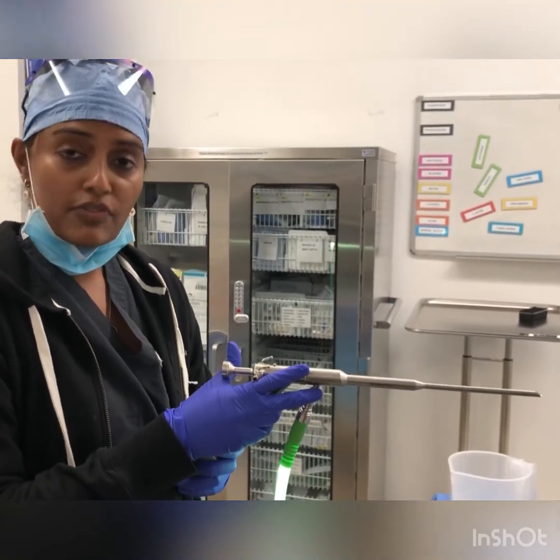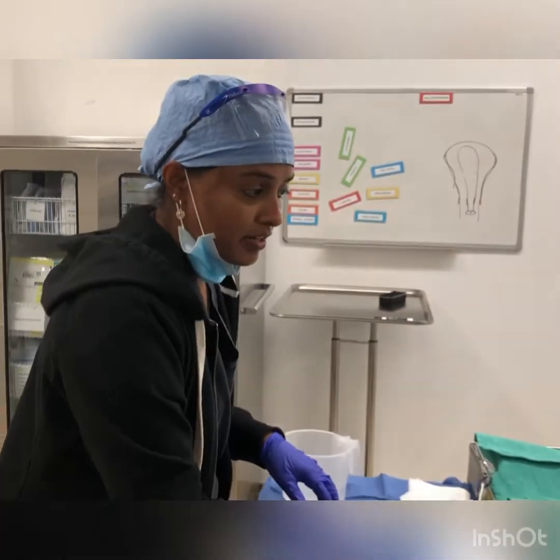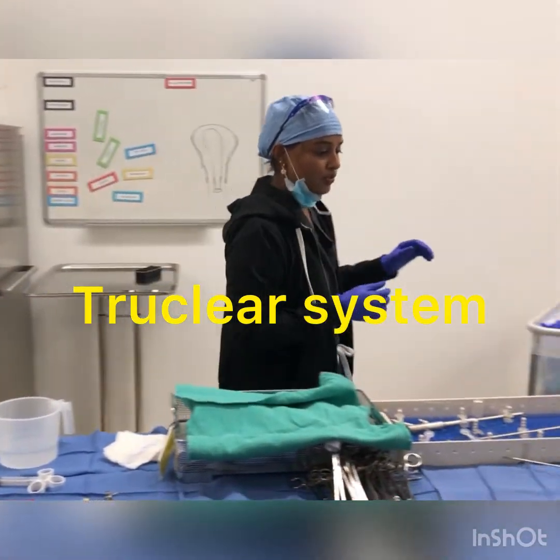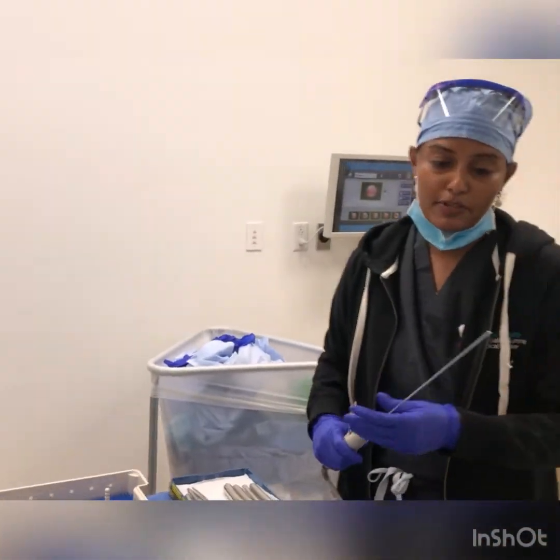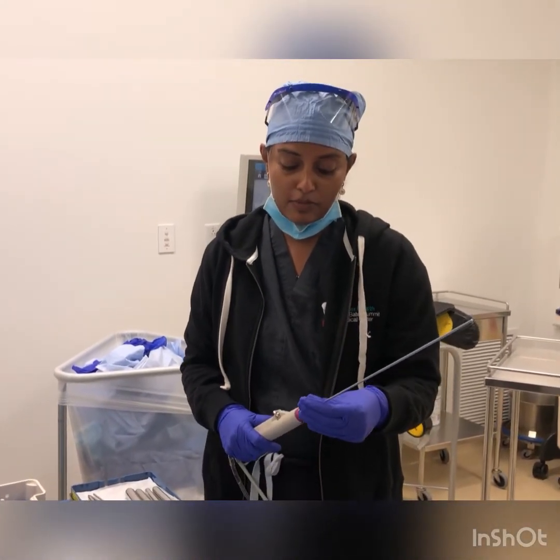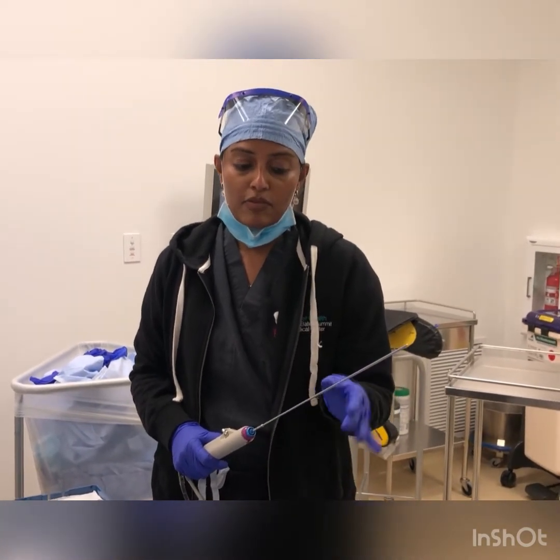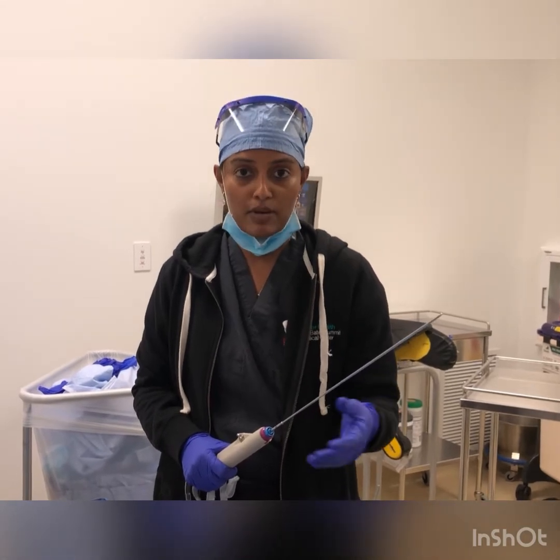We have different types of systems that help us do this. I personally really like the TrueClear system, and that's the device that I use. I'm going to show you the blade. There are different types of blades here. This is a very small, thin blade that helps with very fleshy polyps. And then we've got 2 other blades that are much tougher that can help with fibroids.